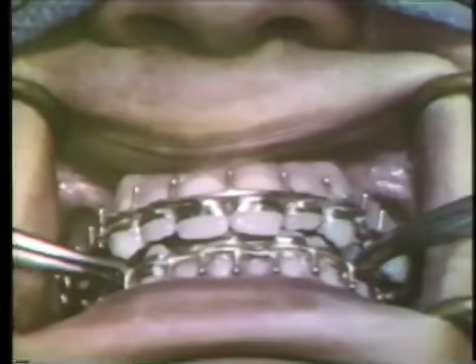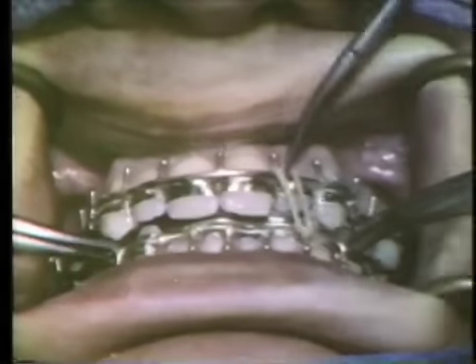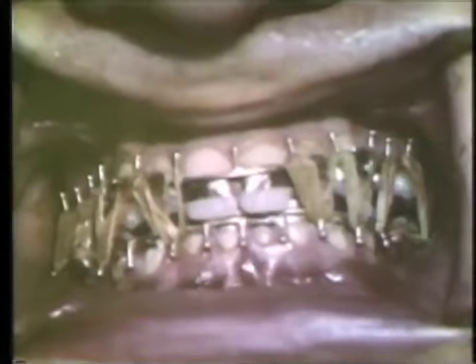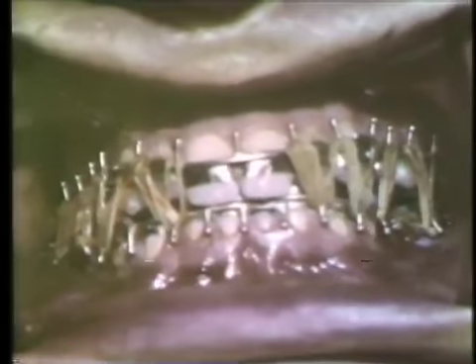Note the great mobility of the anterior segment. Once it's been divided, you can put this anywhere you want to. In this instance, it goes to a predetermined occlusal position that is a fine target, and there is the immediate satisfaction of knowing that the arbitrary fracture and bone removal has achieved a correction.